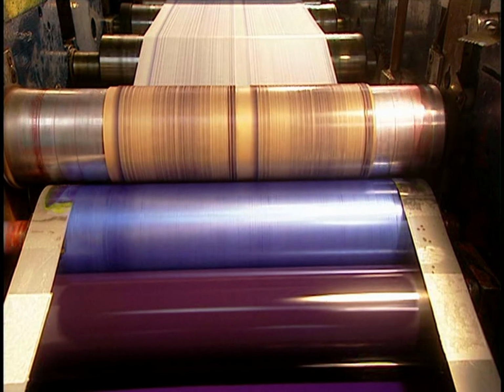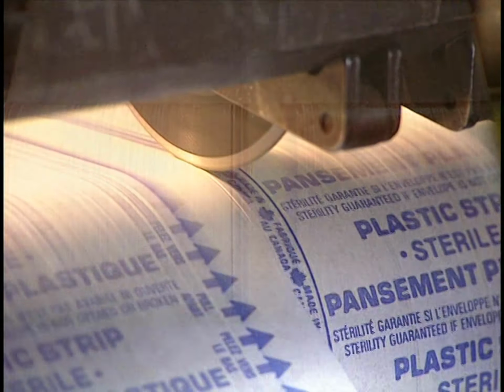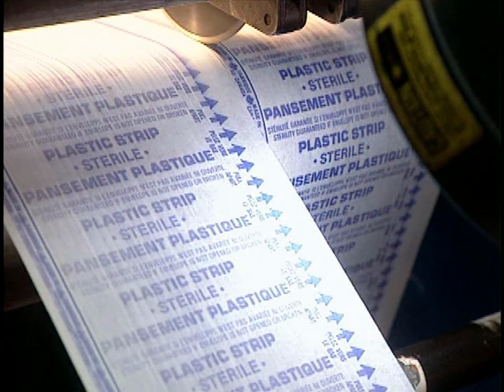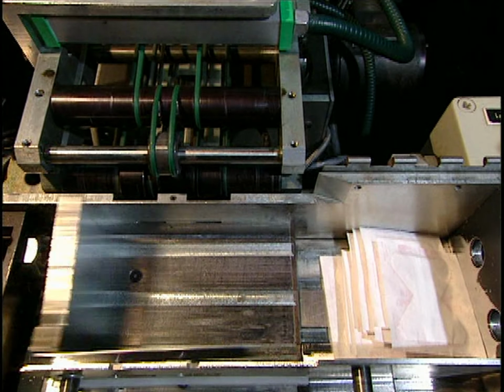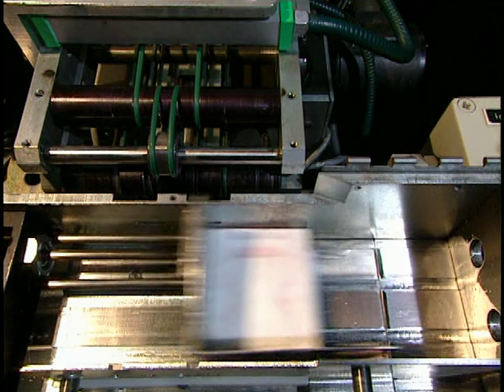2 polymer plates receive ink from a series of rollers in order to reproduce the desired design. The bandages pass through at high speed. Before being packaged, the bandages are finally sterilized, 10,000 at a time. Bandages are automatically counted here, placed in a chute, and fall into the packaging box.